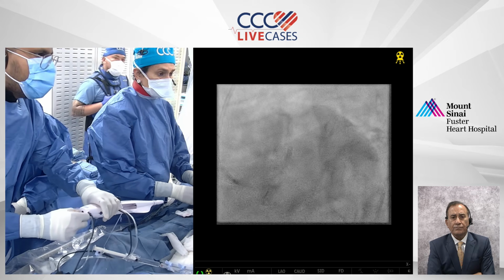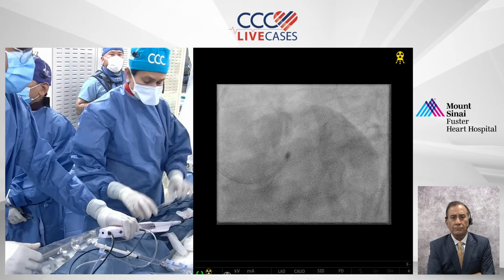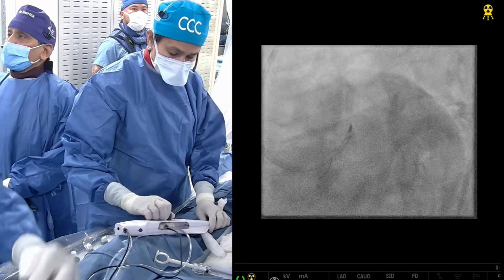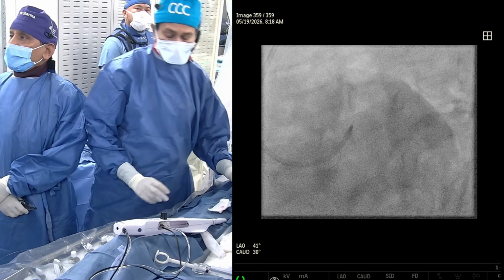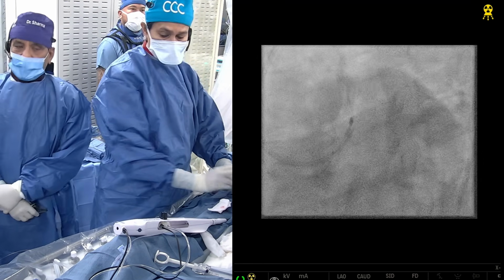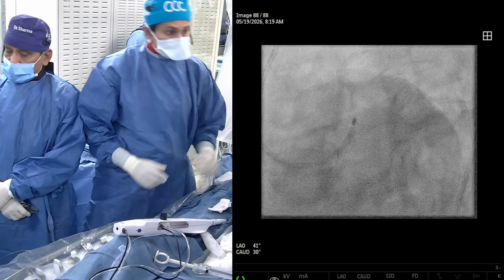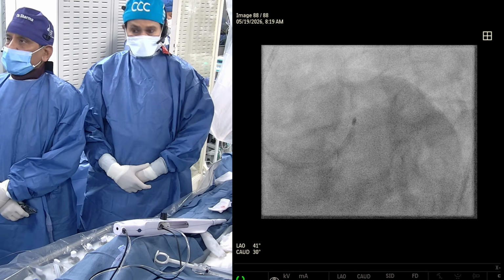So in this case, it's a little more complicated. Patient also has mild to moderate aortic stenosis. Although once the valve area is more than 1.3, in the trials, anything more than 1.2 was not a contraindication for Impella trials. But in this case, for that region and good left ventricular function, good circumflex, RCA has been taken care of. I think based on all the definitions, this case could be done as a standalone without Impella. Of course, if some trouble happens, which is very rare, then you use Impella.